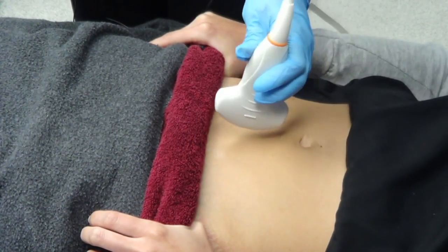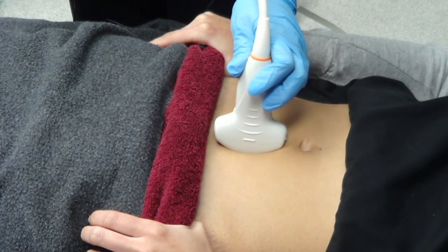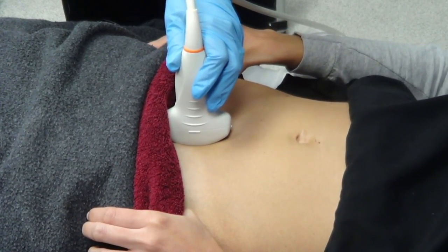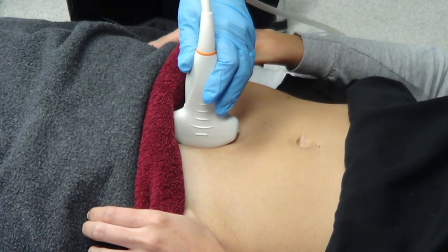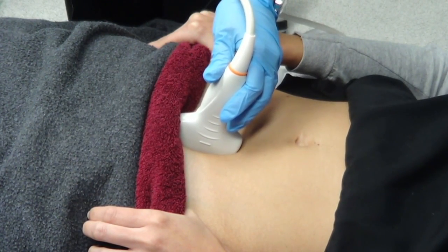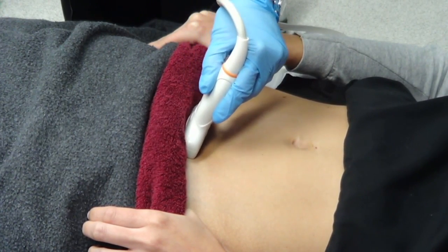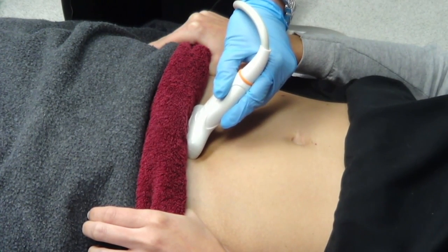So when we place our probe, we might be placing it initially right in between the two structures, the umbilicus and the pubic symphysis, and then sliding our probe down, and then we want to look past the brim into the true pelvis where our bladder and our reproductive organs live. To do that, you may have to toe the probe a little bit. In transverse, you'll want to just aim it, or you might angle it into the pelvic inlet to be able to see your structures in transverse.